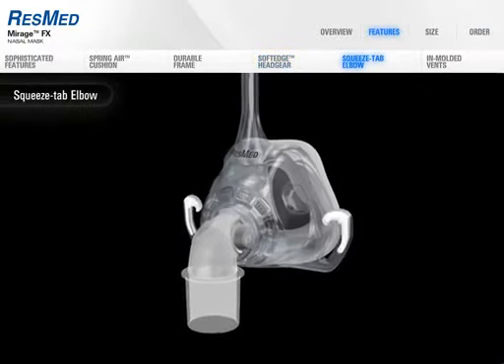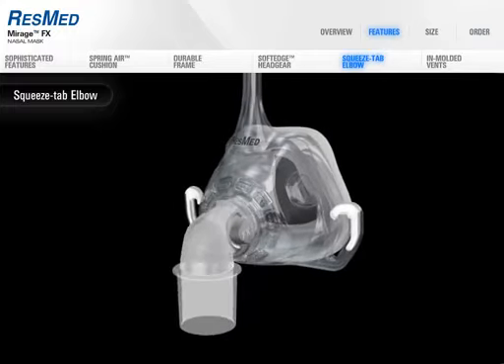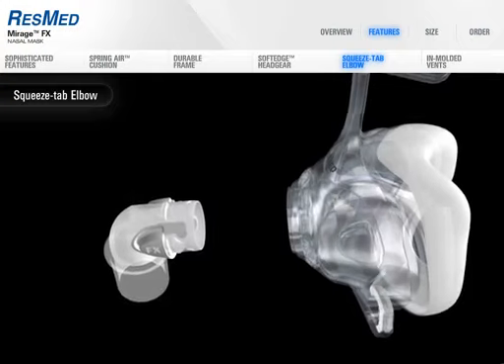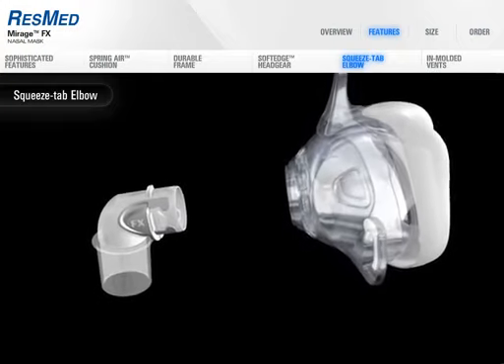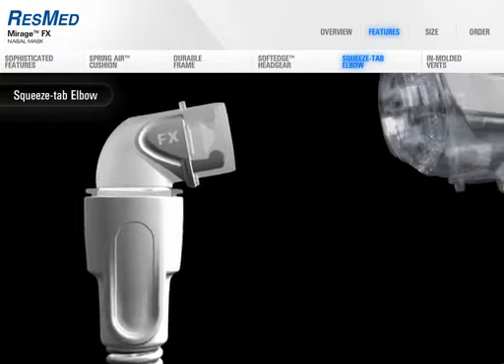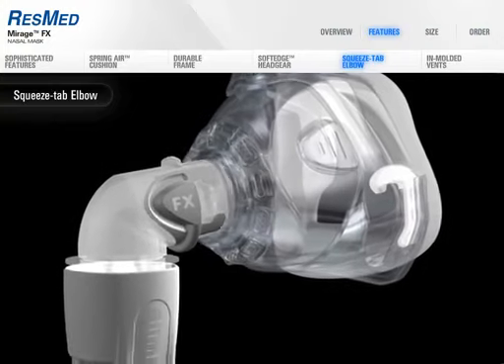The innovative squeeze tab elbow to cushion assembly is another way Mirage FX achieves both sophisticated design and easy functionality. New materials used in the elbow have eliminated squeaking, while innovative manufacturing has produced a one-piece elbow, which means no lost parts.